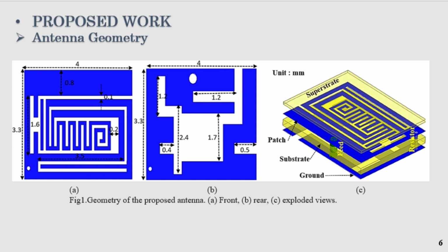These materials were chosen for their beneficial dielectric properties, including flexibility, adaptability, and biocompatibility, making them suitable for medical applications. The antenna is excited using a coaxial cable, contributing to miniaturization, as coaxial cables occupy less space than microstrips.